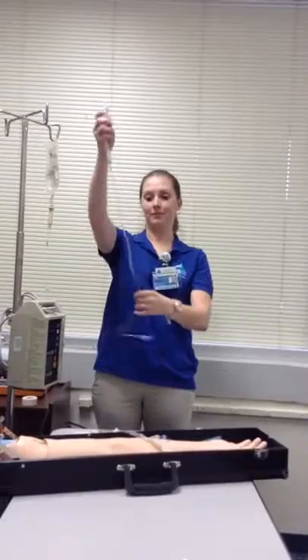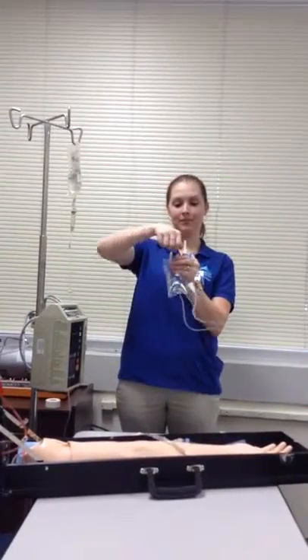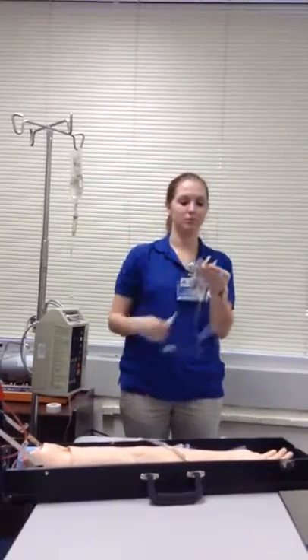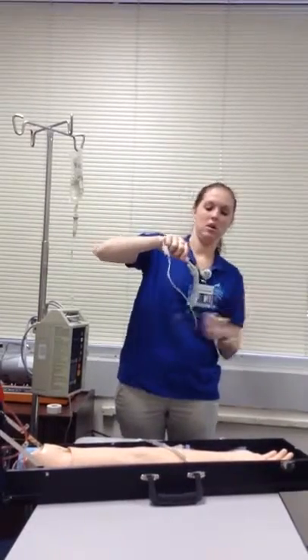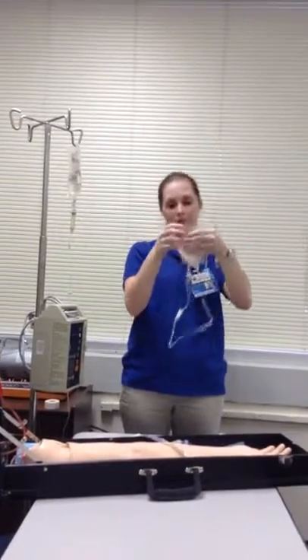I would then go ahead and get my tubing, and I would make sure that it is clamped closed, pull this off, and spike the bag. And then I would squeeze, squeeze, squeeze.